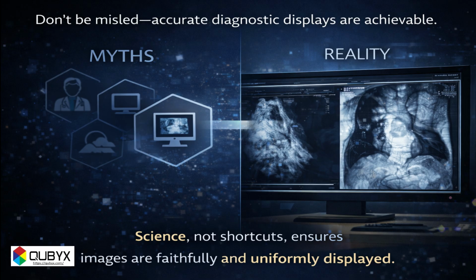Several myths persist. Factory calibration is not enough. Only medical-grade monitors are not the only concern. Remote reading does not reduce the need for standards. In reality, remote radiology increases variability, making DICOM Part 14 even more important.